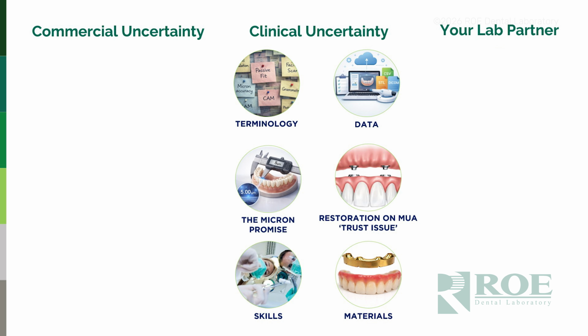So for example, if a milling machine is being used with worn tools, that is going to affect the accuracy of the final bridge. Even the temperature of the room that the milling machine is kept in and the humidity will affect the accuracy of the milling. And so then it goes to sintering, and it goes to manual handling. All of these things will have an impact, maybe positive, also potentially negative. And so the accuracy can deplete across that workflow. So it is important to understand that.